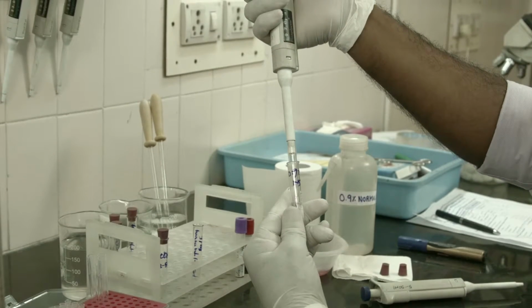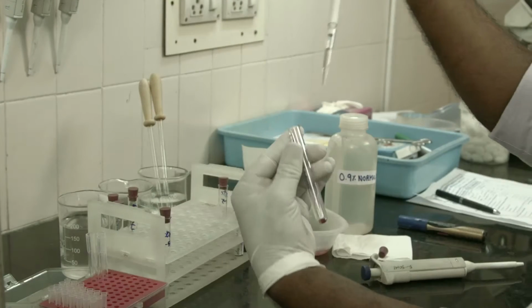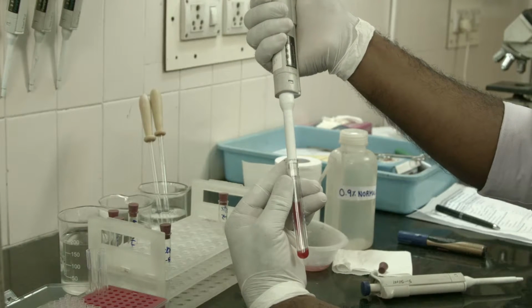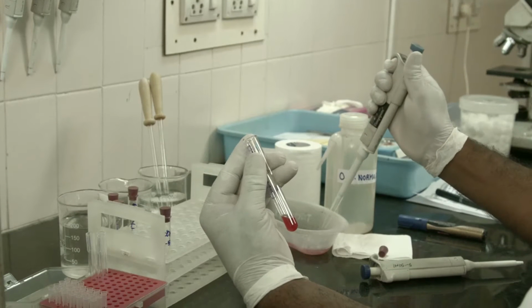Take 30 microliters of washed red cells from the red cell button and add 970 microliters of normal saline, which will give 1 milliliter of 3% cell suspension. This suspension will have a color mimicking tomato red.